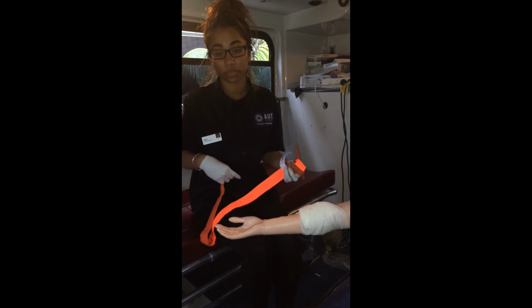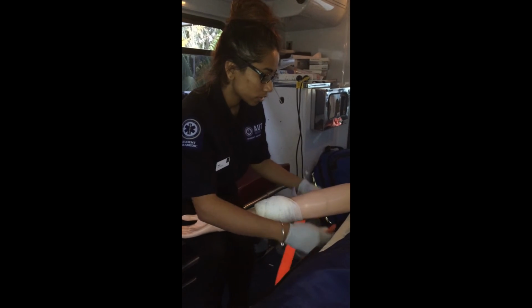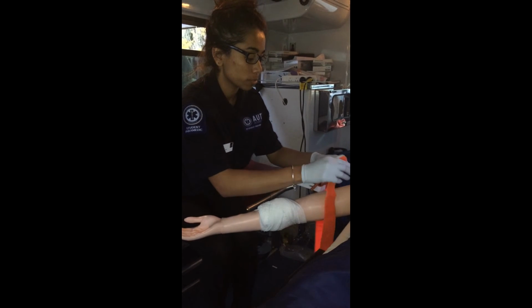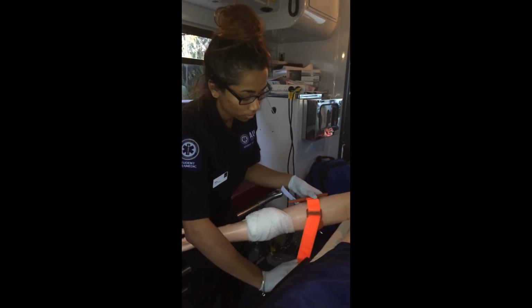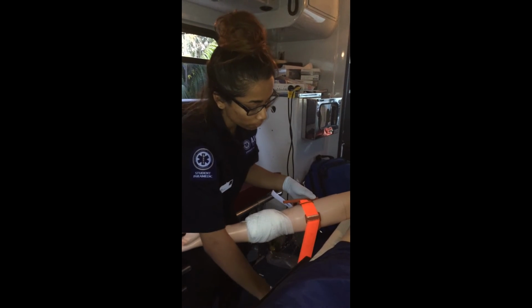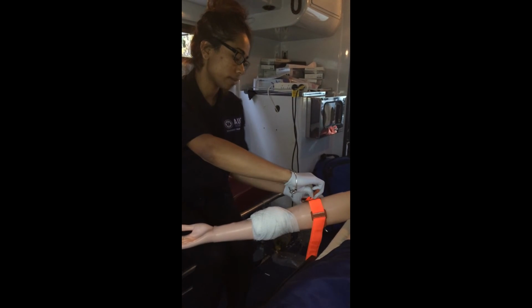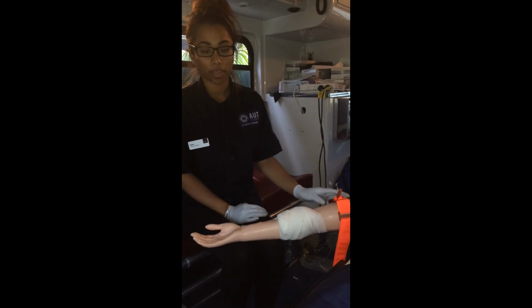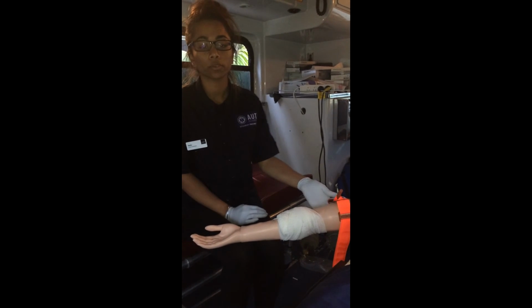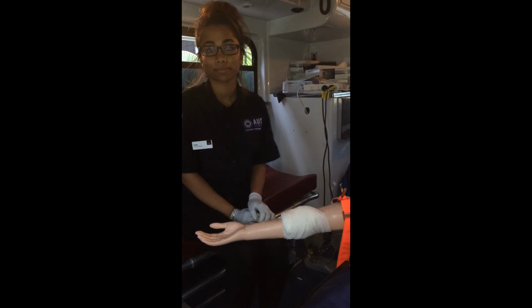So now I will demonstrate how to use a tourniquet. So you want to apply it 10 centimeters proximal to the wound, like so. Twist the windlass and apply the time strap. So this is when you will then place the time of application on the strap itself, and also then feel for a distal pulse and hope that the bleeding will have stopped.